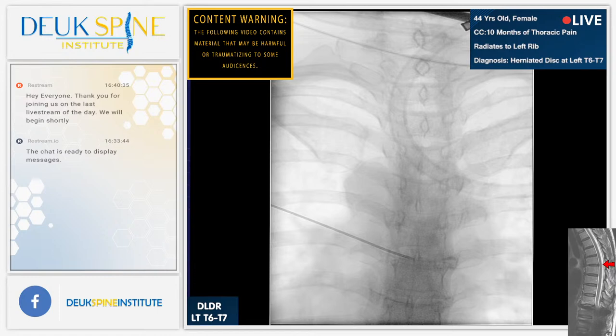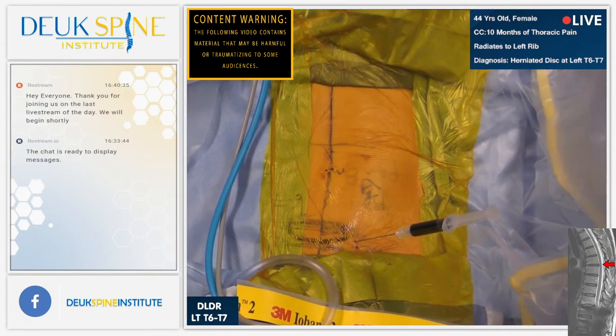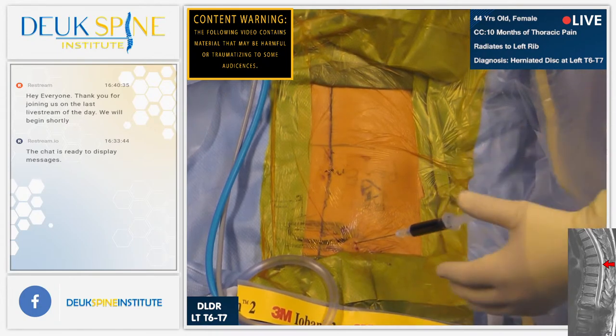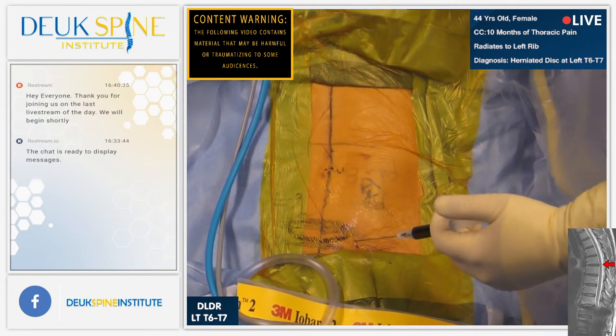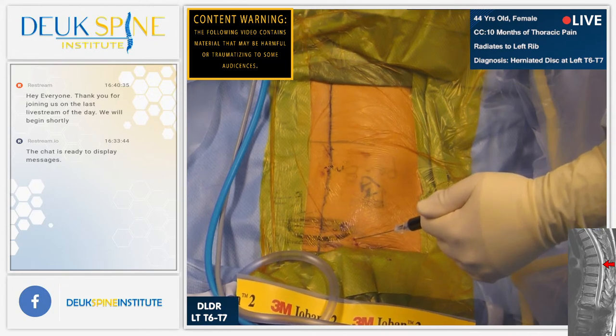Are you awake? All right. How far out is she? Probably about 3 or 4 more minutes, maybe 5. All right. So I'm going to do what's called a discogram. Normally we want to see if she feels the pain when we do it, but we're going to do it anyway. Shot?